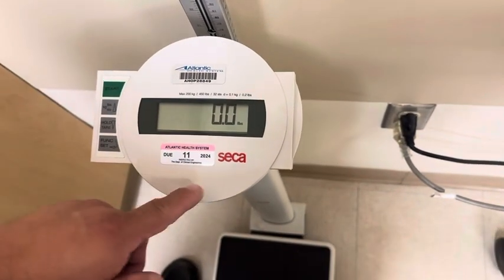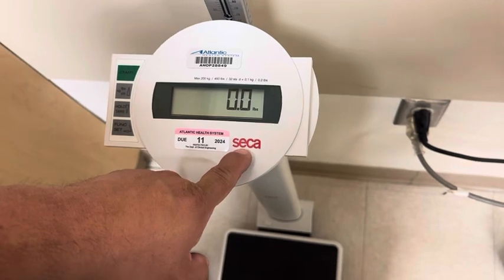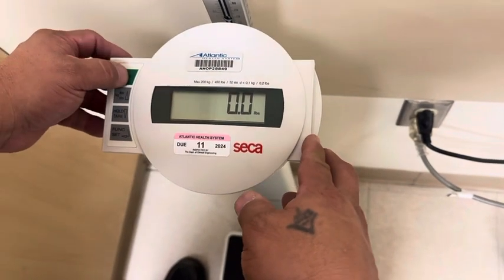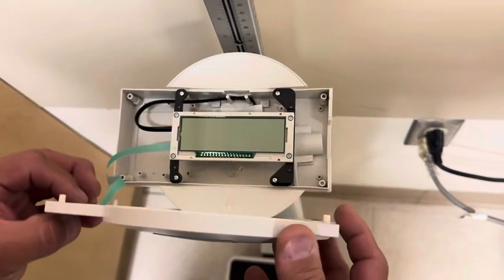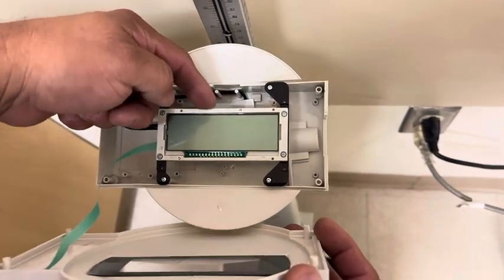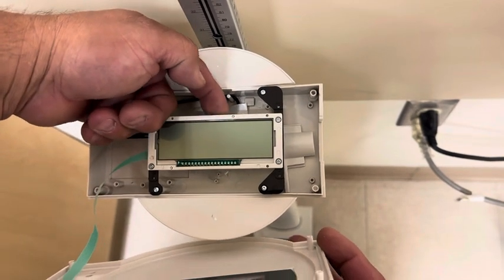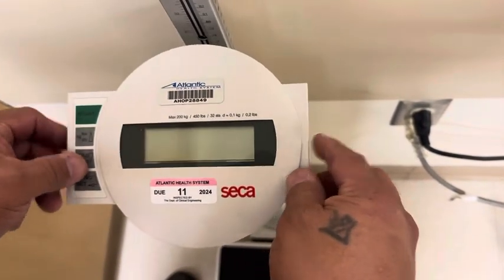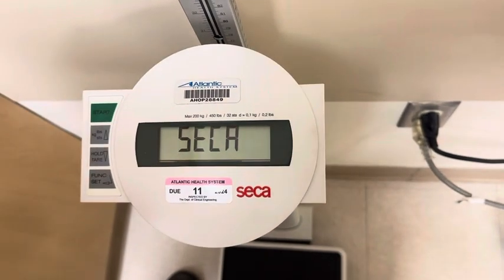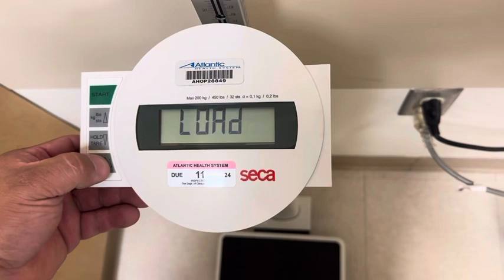This is a calibration adjustment of a Seca 769. Basically, you're going to shut it off, and underneath there is a switch that you have to move to the left. Turn it on and it reads 'LOAd.'